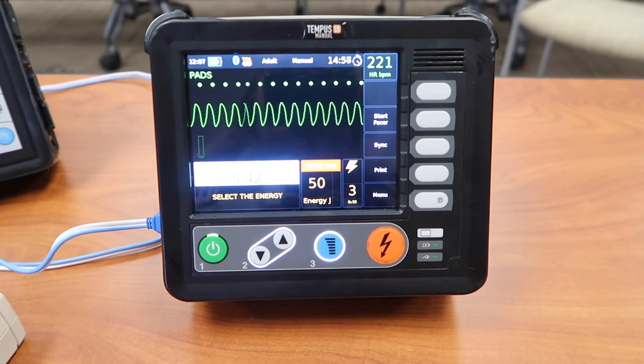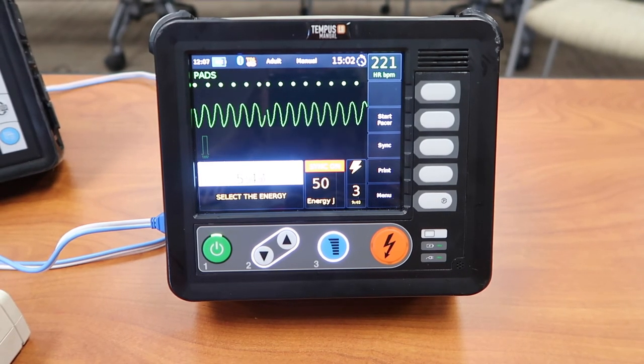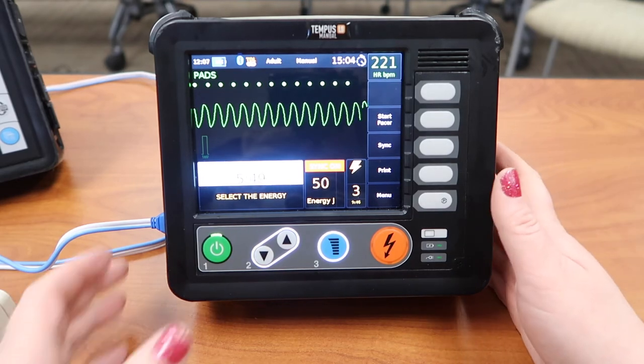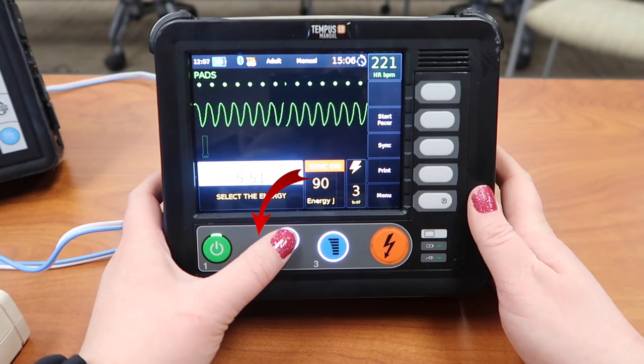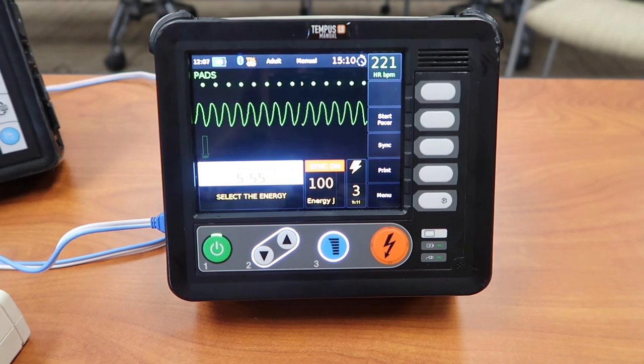Let's say your local protocol states that if a patient has wide complex tachycardia like VTAC, you want to set your energy at 100 joules. So that's what you do. And you just use the gray arrows for up or down. And after you have your energy selected, you want to go ahead and charge it.